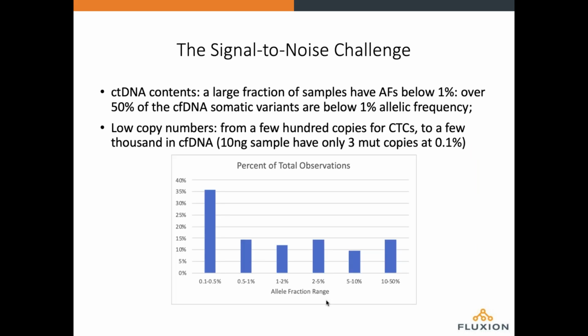So the next question you might want to ask is, well, what are these allele frequency variants for tumor-derived somatic variants that you see in blood? And we've got now extensive experience through working with a few clinical labs out there where we see a variety of somatic variants, and then we can, as you'll see in a second, verify that those variants are truly there using orthogonal techniques.